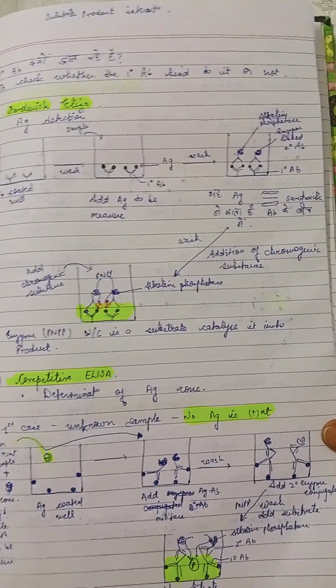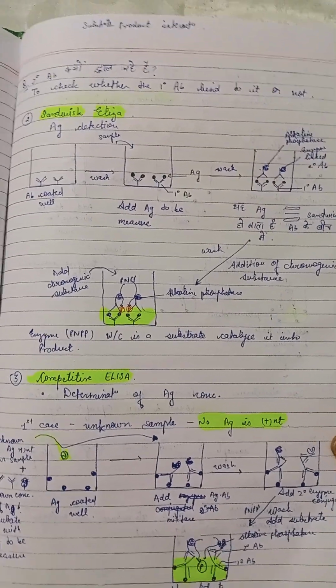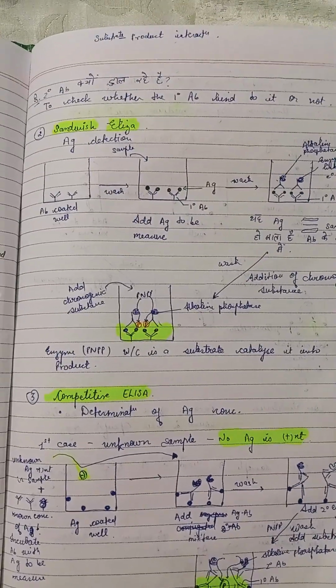Again, addition of a chromogenic substrate gives a colorful product.